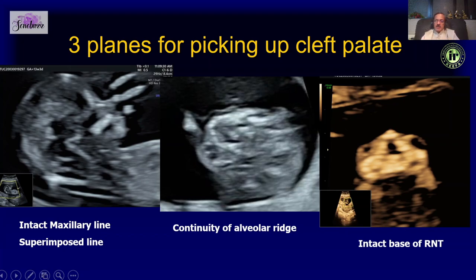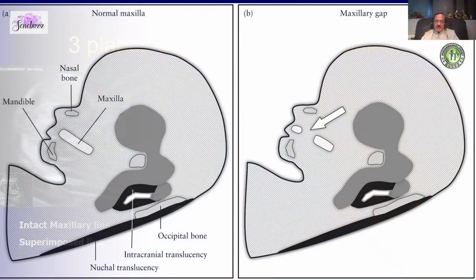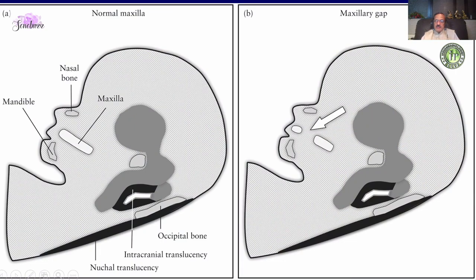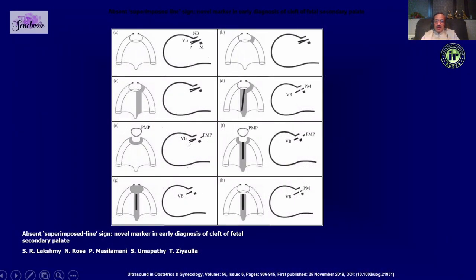The maxillary gap sign described by Rabbi Choy some years back is reliable but has been challenged by some. What Dr. Lakshmi describes is the superimposed line — basically the vomer superimposed on the palate. She has published articles in both the ISUOG journal and the AIUM journal which I urge you to read.